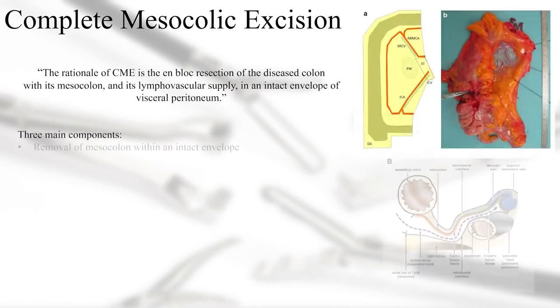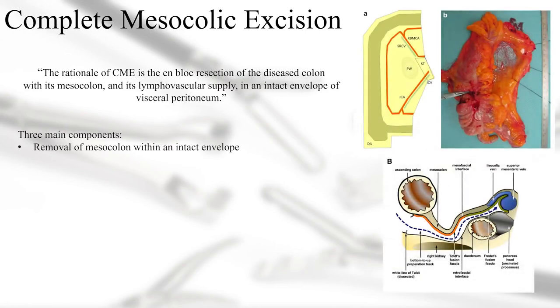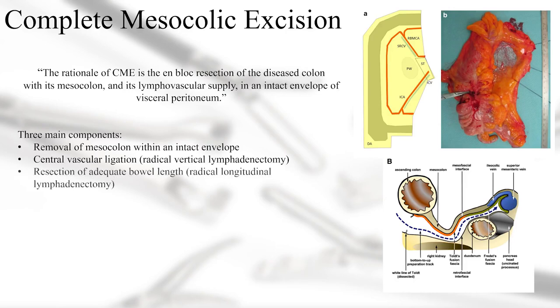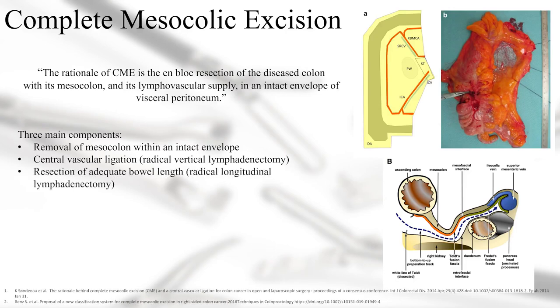The three main components of the technique are: a meticulous mobilization of the mesocolon away from the retroperitoneum without breaching the fascial layer; a central vascular ligation together with a central lymphadenectomy along the anterior border of the superior mesenteric vein; and finally, the resection of adequate bowel length in order to perform a correct longitudinal lymphadenectomy.